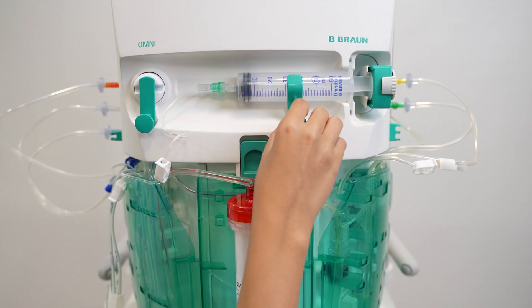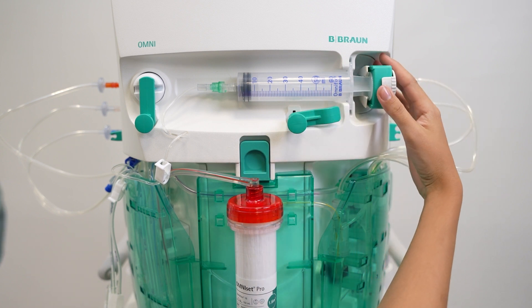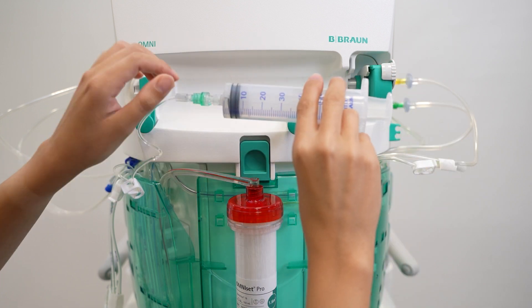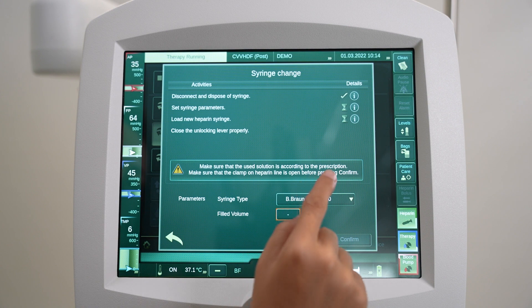Open the unlocking lever and the syringe holder by flipping the clasp nut. Remove the syringe piston plate from the clip and the gripping plate from the slot. Disconnect the syringe from the heparin line.